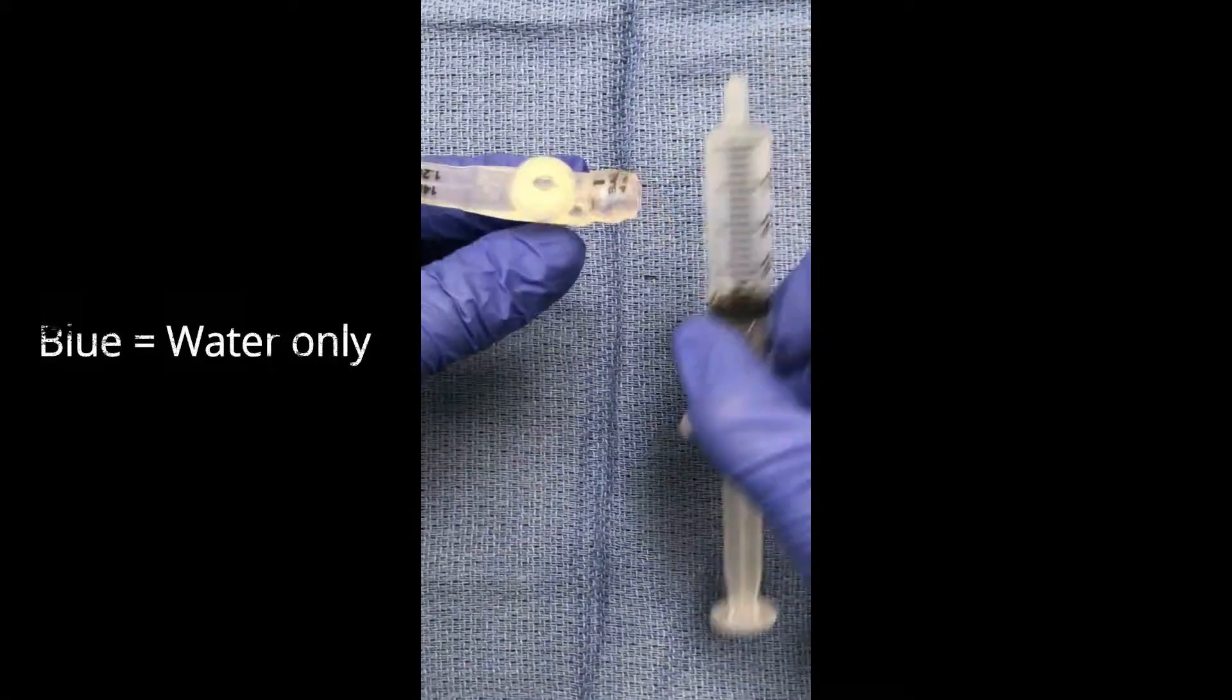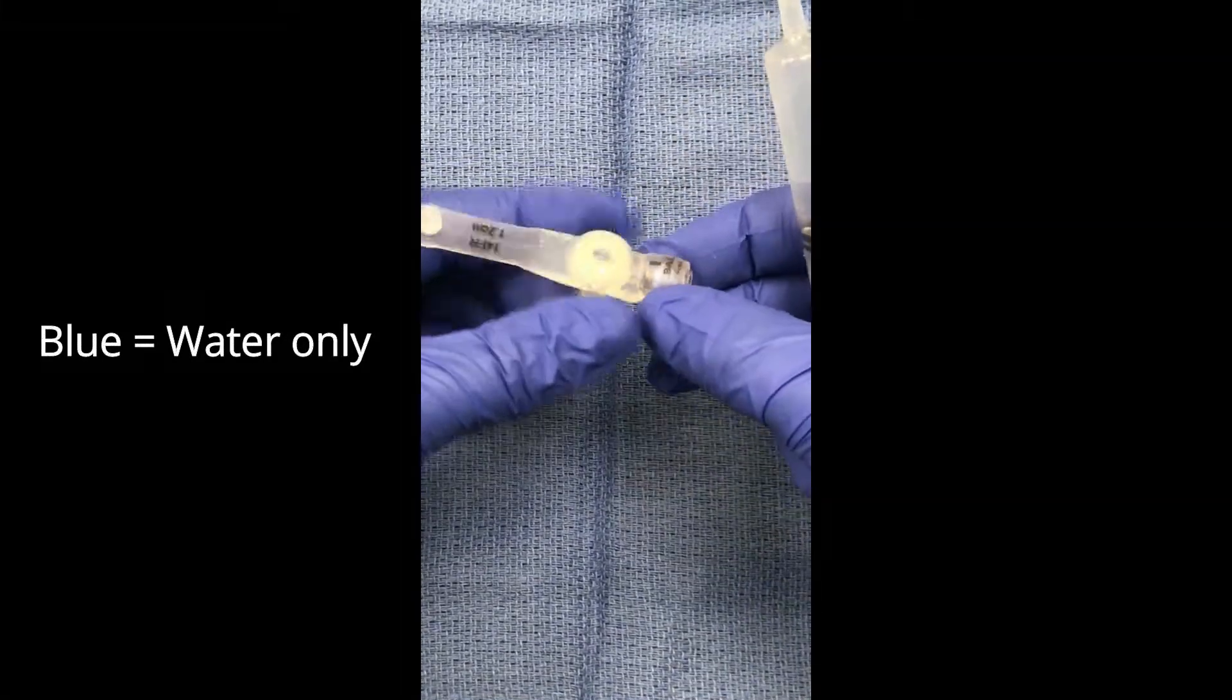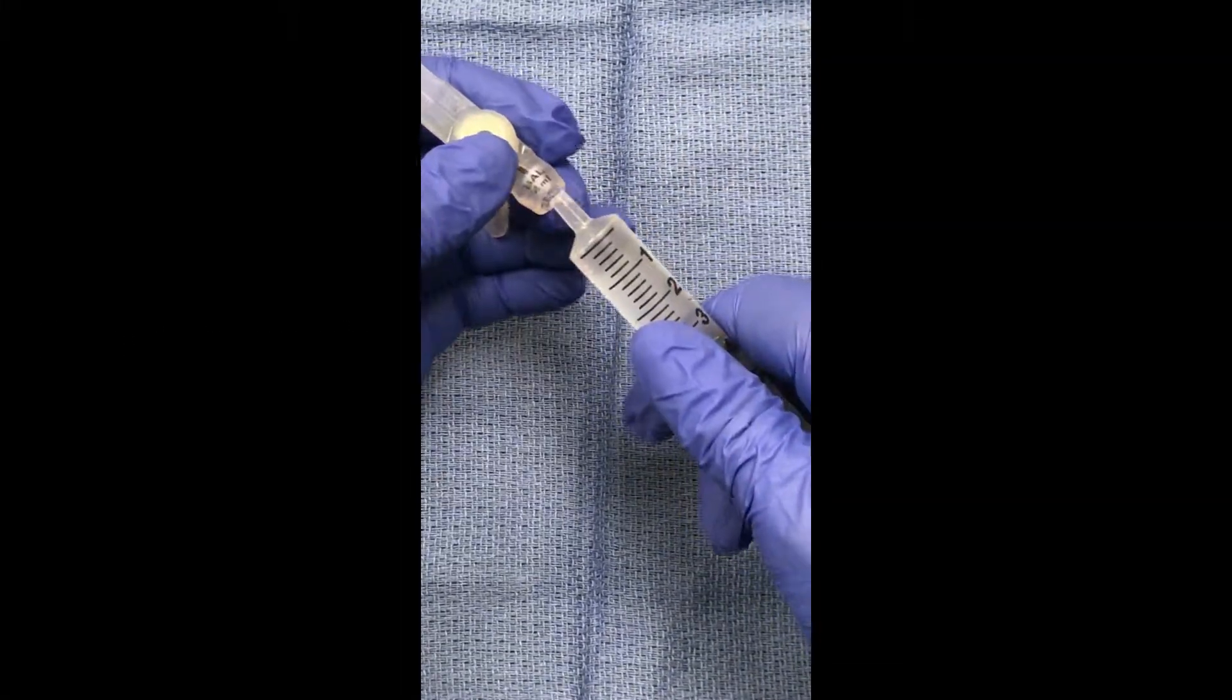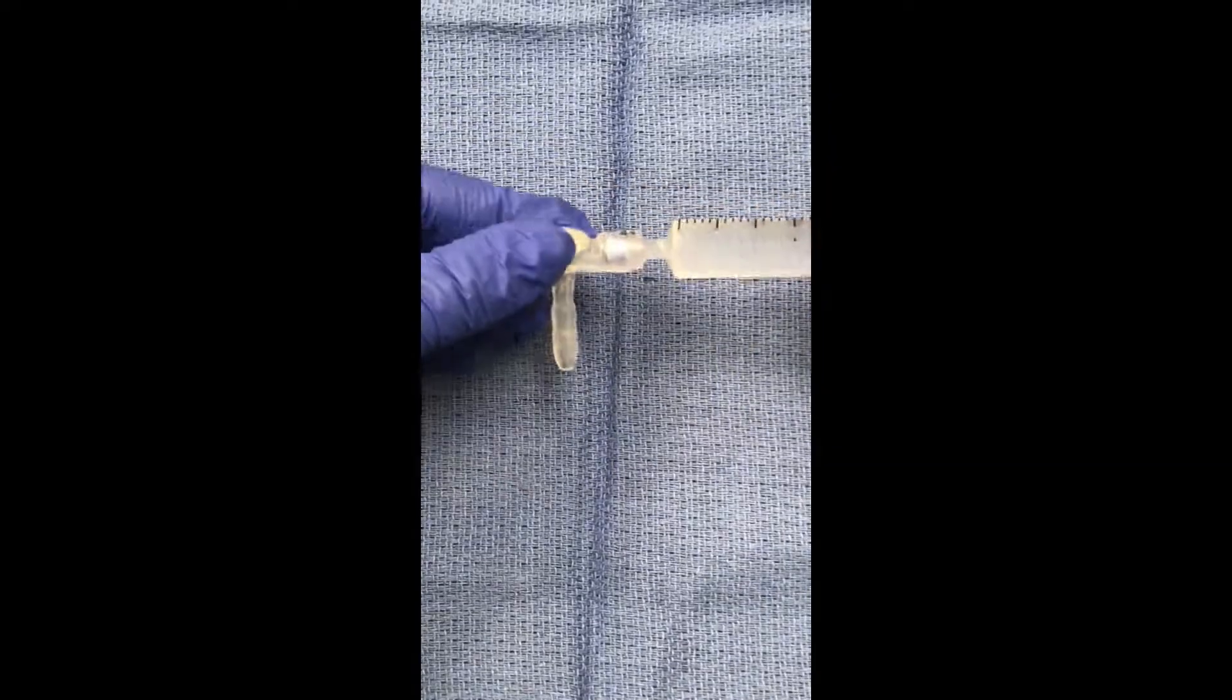In order to inflate, you'll need a slip tip syringe with the appropriate amount of water. Insert into the side port and slowly infuse the water.